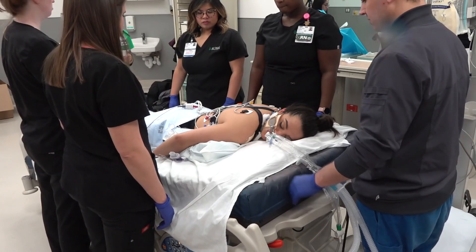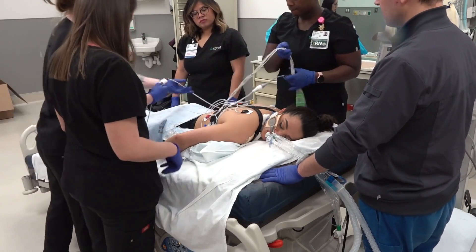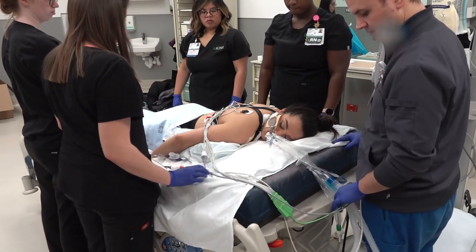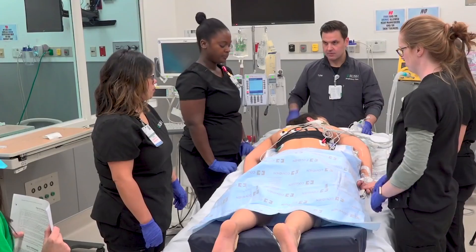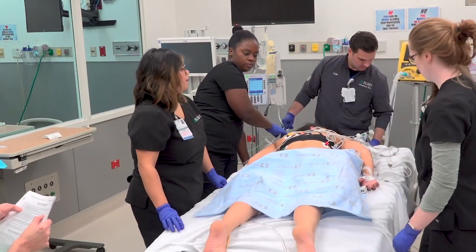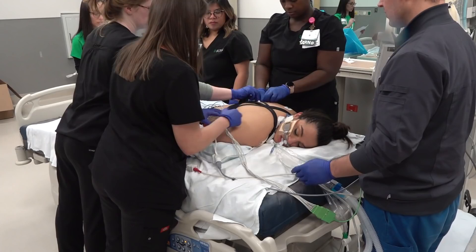Steps for manual supination. We will now teach you how to place the patient back to the supine position from the prone position. First, we will ensure that lines and tubes from the waist up are positioned toward the head of the bed, and lines and tubes from the waist down are positioned toward the foot of the bed. We are going to ensure we have enough slack present, maximally inflate the bed, and place it in flat position. We will remove the patient's gown, EKG leads, and EKG electrodes.